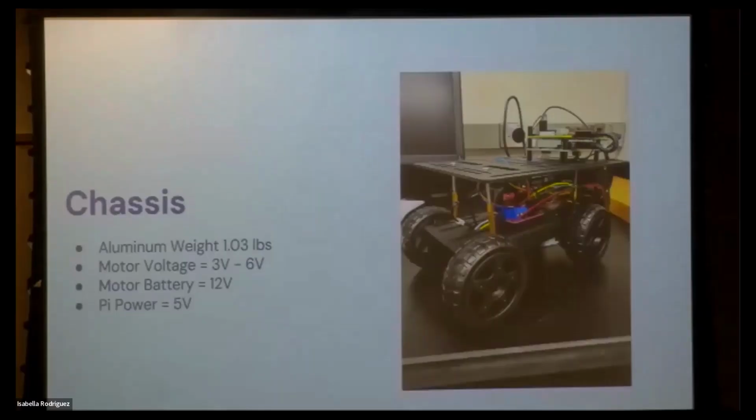Our chassis is super lightweight. Keeping in mind our budget, we knew we were going to have smaller motors, so we didn't want to put too much weight onto the chassis. During the semester, we'll talk a little more later about the first camera option we had.